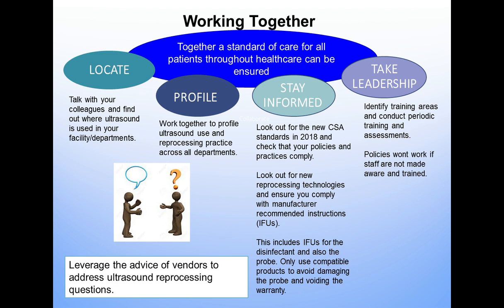Stay informed, look to the new CSA standards, which Merle mentioned are coming out in 2018, and make sure that you've read the IFUs of the probe and any products that you're using in association with that probe. And I think also, leadership and training, it's well and good to have a policy, but actually making sure that people are carrying that out is critical.